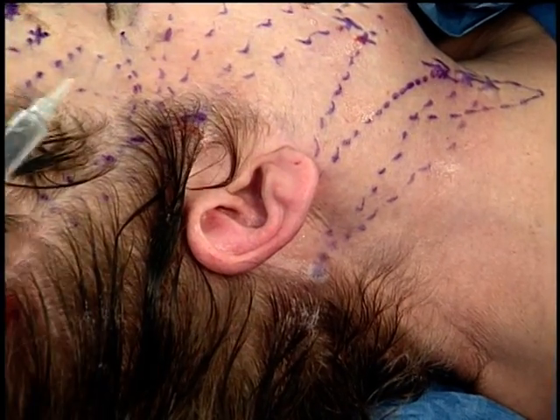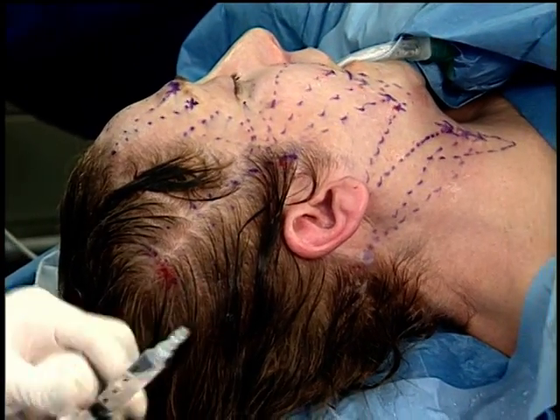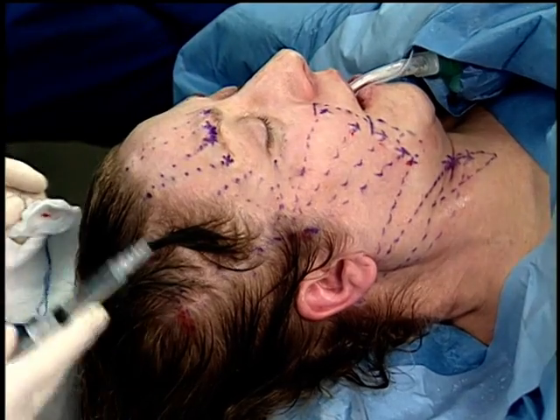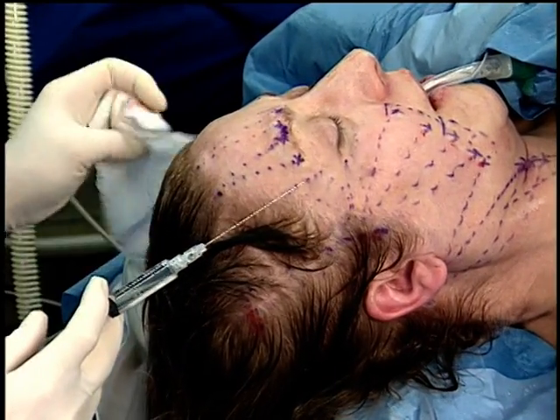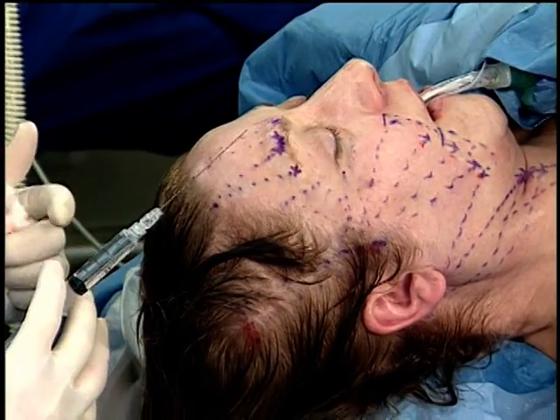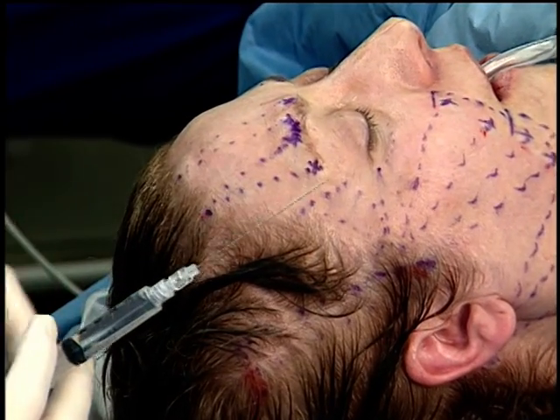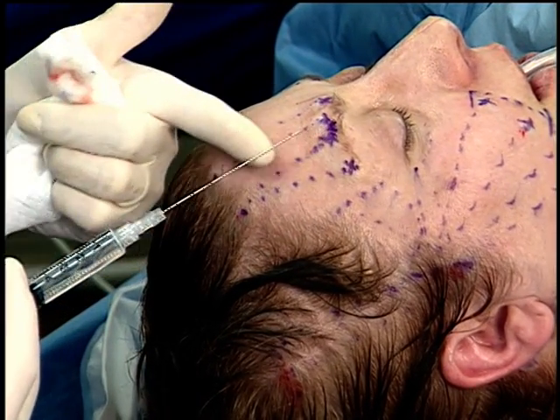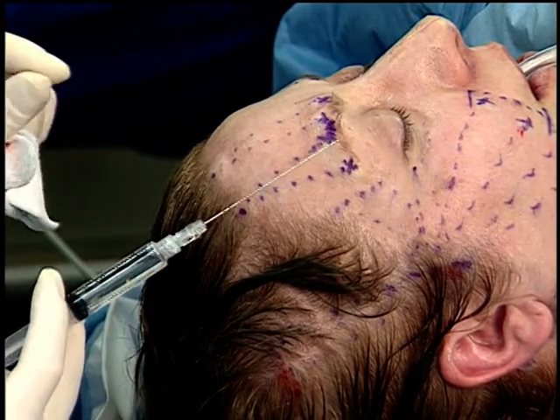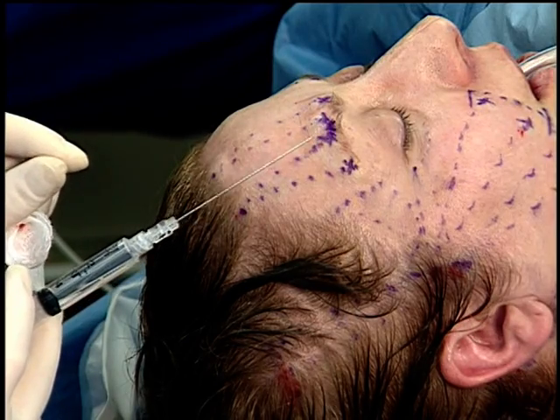Now that we've done all our intradermal anesthesia, if we back out, I now do my tumescent tunneling. This is the most critical phase of the procedure before deploying the needles. If you do this properly, the deployment of your articulus needle becomes simple. You must visualize the depth of the tissue that you're going to deploy that articulus needle. It's going to be in the subcutaneous space. If you hydrodissect using your 22 gauge needle in the subcutaneous plane, that is the buttery, smooth, soft layer that your articulus needle will pass through.